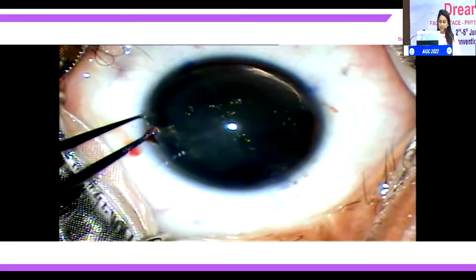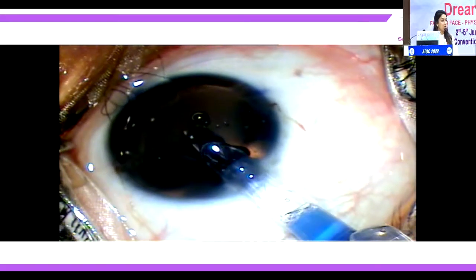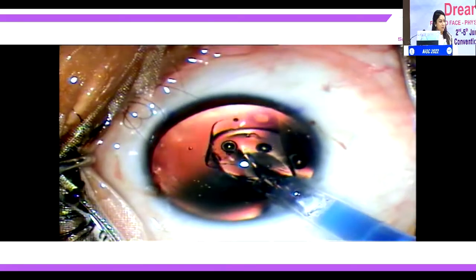Coming to the surgery, be very generous in using viscoelastic, because we don't want to touch the anterior lens capsule. So like you see now, a phakic IOL is not done wound assisted. You have to go inside the wound. For IPCL, you can make 2.8. For ICL, you need 3.2 incision.